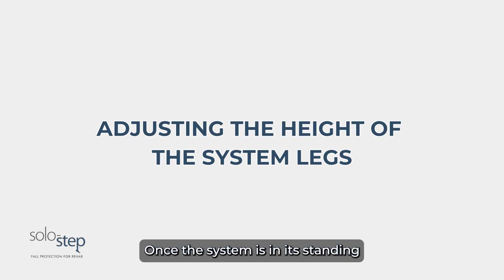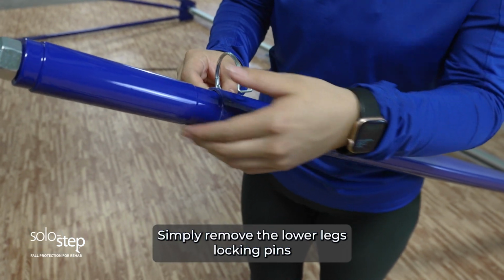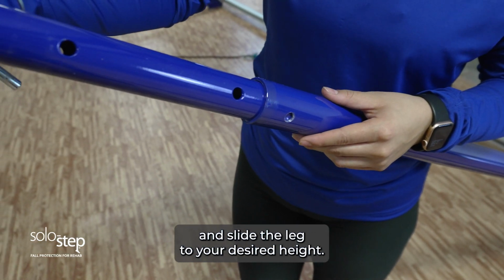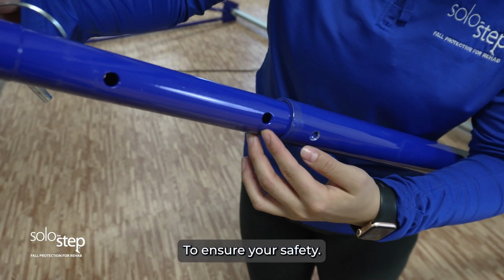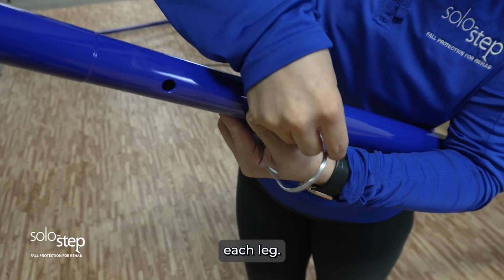Once the system is in its standing position, you can adjust the height of the legs. Simply remove the lower leg's locking pins and slide the leg to your desired height. To ensure your safety, use 2 to 3 people to help you lift the system to adjust each leg.